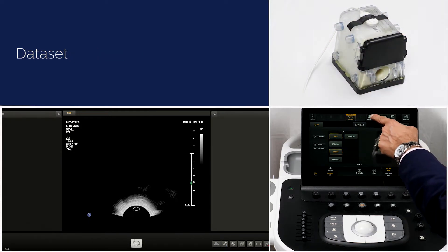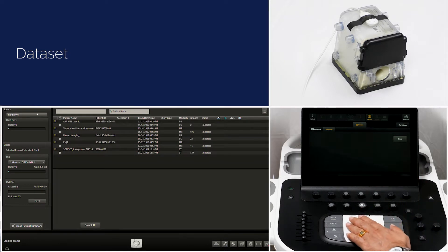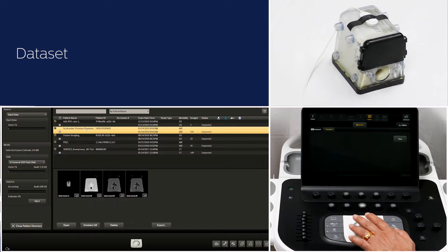Load the MR dataset by either using CD, DVD, USB, or you can query retrieve it directly from PACS. We usually use axial MR data with T2 sequence, preferably with 2 mm slice thickness. We can also support non-axial datasets, that is coronal and sagittal planes.